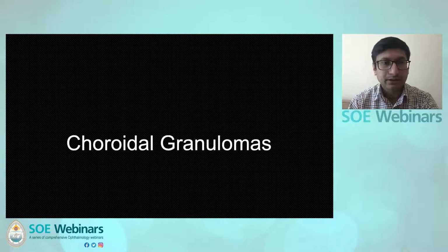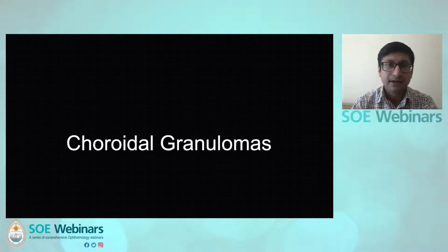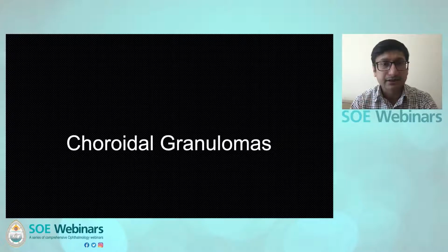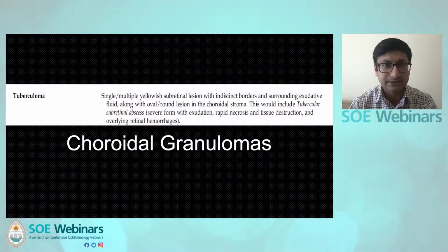When we talk about choroidal imaging, one of the most important disease phenotypes that benefits from choroidal imaging is choroidal granulomas. As we see in the examples that I discussed, tuberculosis and sarcoidosis form the two most important reasons why you can have choroidal granulomas. A choroidal granuloma due to TB is now called a tuberculoma, and it usually presents as single, sometimes multiple lesions which are yellow, which have indistinct borders and surrounding fluid. You can have rapid necrosis, exudation, and tissue destruction, and those cases are called tubercular subretinal abscesses.